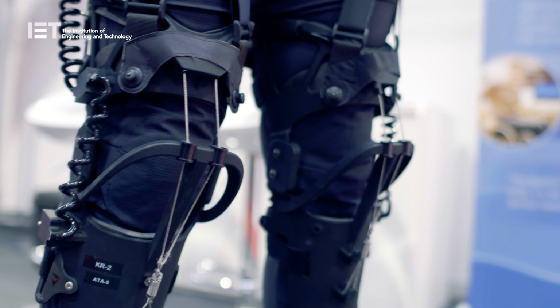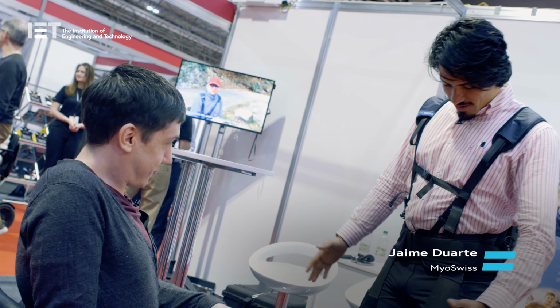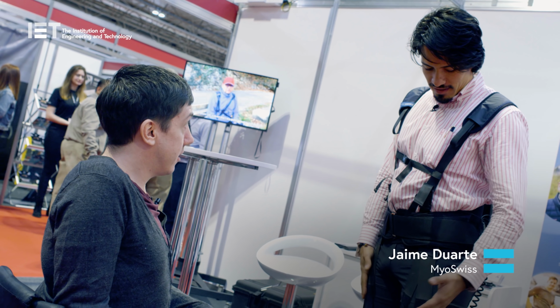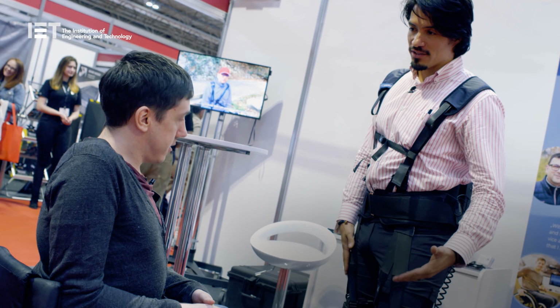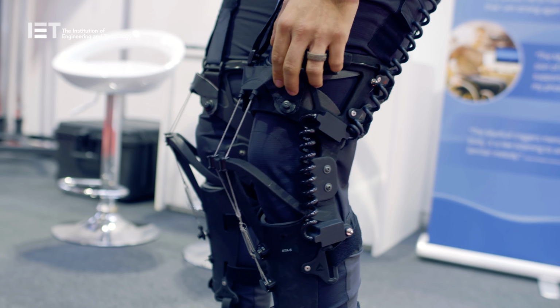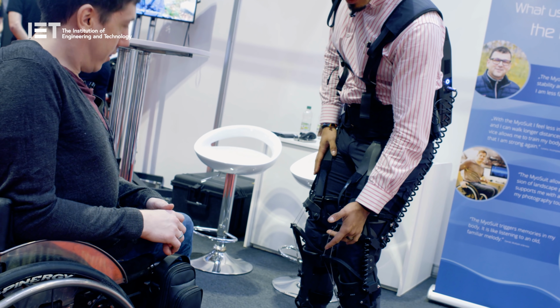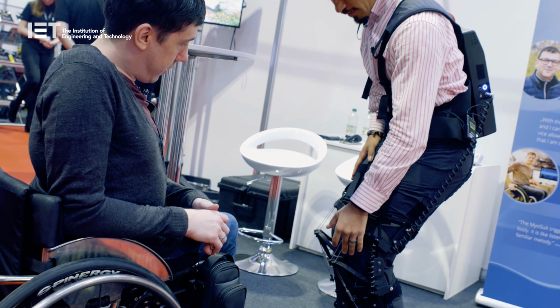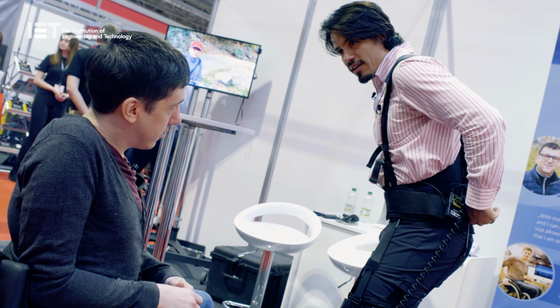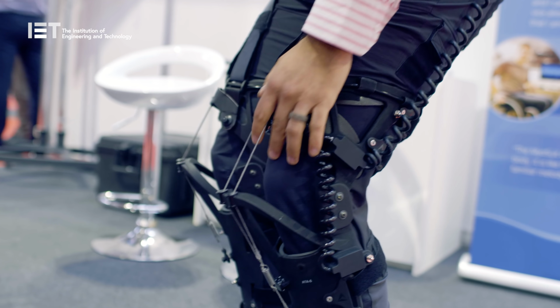This looks absolutely amazing. Can you just talk us through what exactly it is? Yes, so our goal is to build an exo muscle, a muscle for people that need extra strength because their legs are weak or they're getting weaker. So we have here a robotic system. What you see here, these tendons are what provide the assistance. And this tendon goes in front of my knee and then behind the hip. And then I have the muscle stored here. And when that pulls here, it helps me extend the hip and the knee simultaneously.